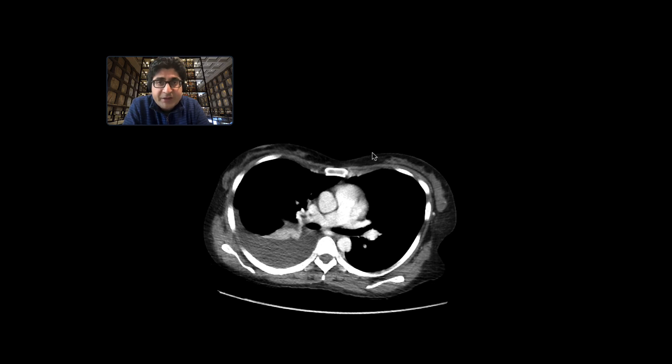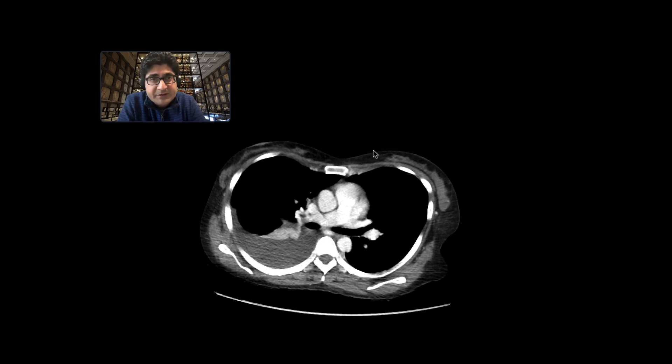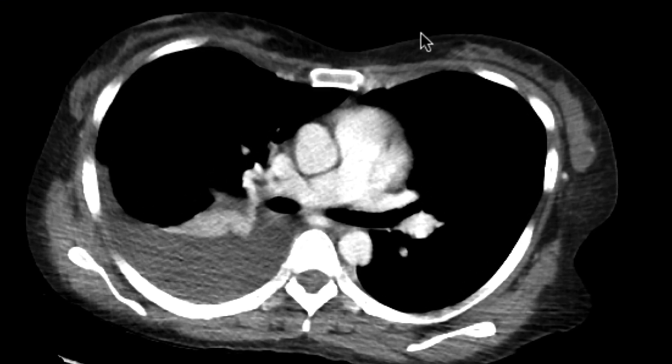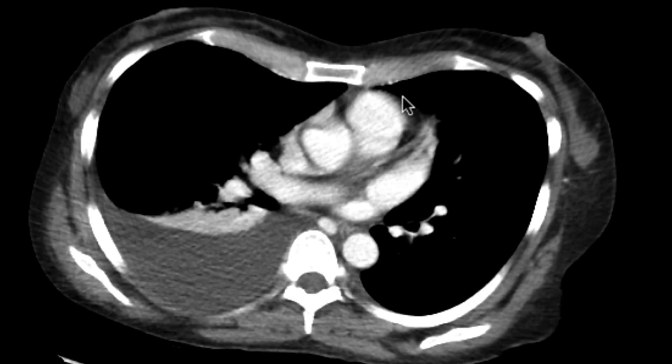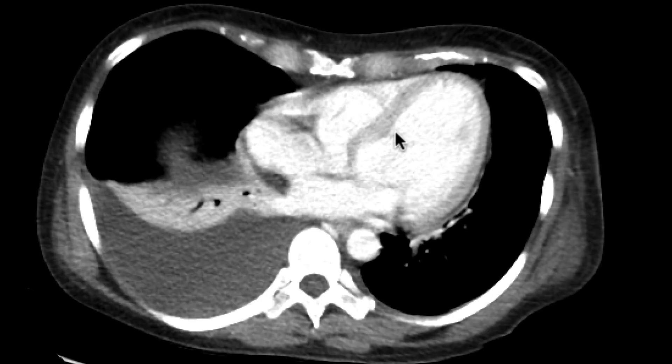This is a patient who presented with abdominal pain and drop in H&H post-paracentesis. We got a CT scan with intravenous contrast to evaluate this.